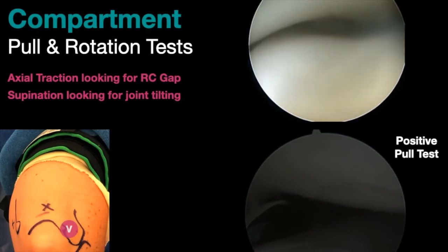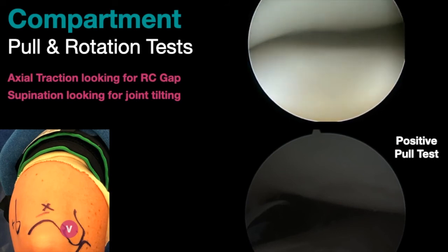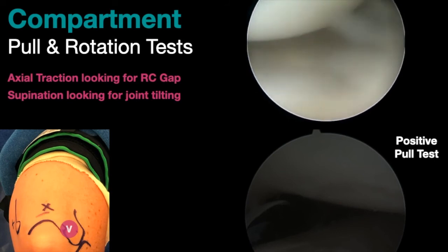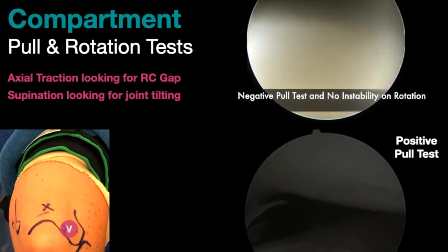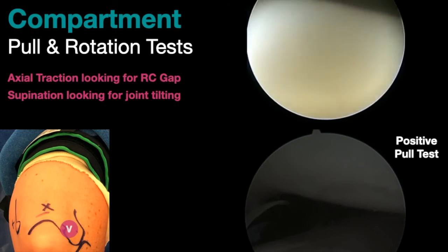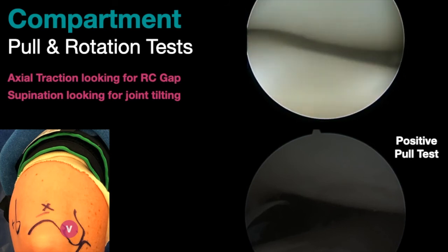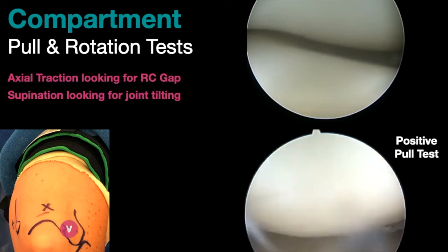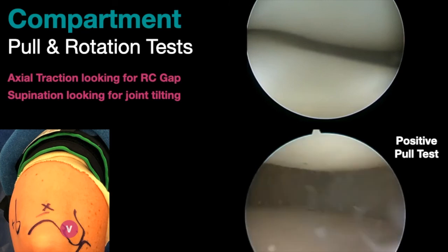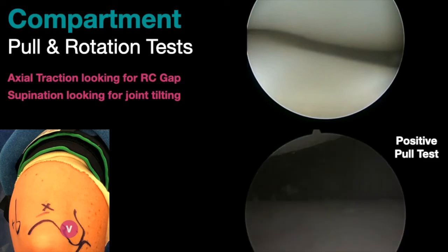We can then perform pull and rotation tests in the posterolateral compartment where we're pulling on the forearm to try and create a gap in the radiocapitellar joints, and also supinating and pronating to see if the radial head uncovers itself, and this doesn't happen in this view. This is opposite to below, where simply pulling and causing traction on the forearm causes the radiocapitellar joint to gap open.